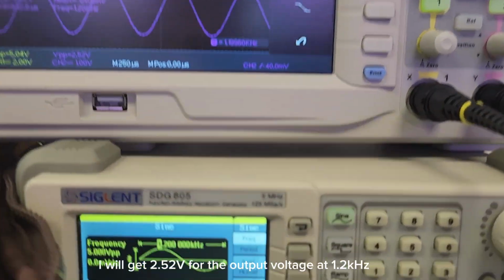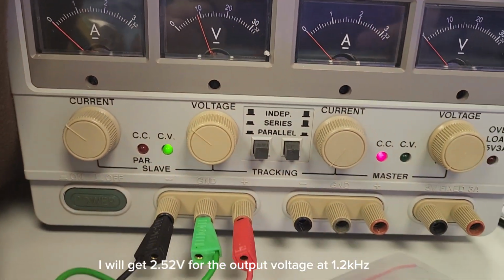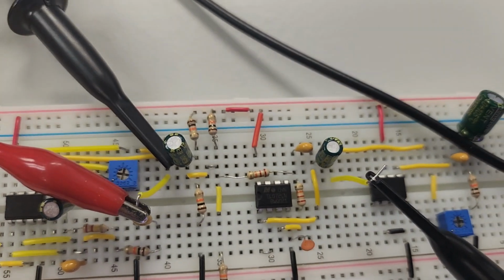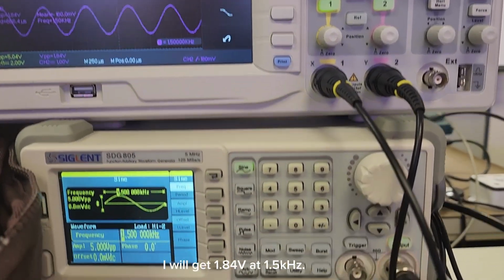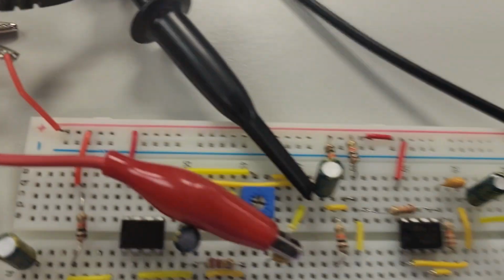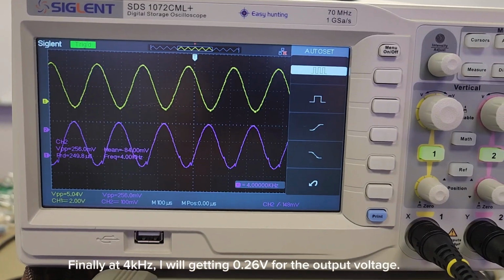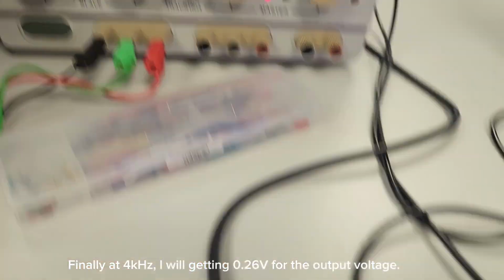I'll get 2.52 volts for the output voltage at 1.2 kHz. I'll get 1.84 volts at 1.5 kHz. Finally, at 4 kHz, I'll be getting 0.26 volts for the output voltage.